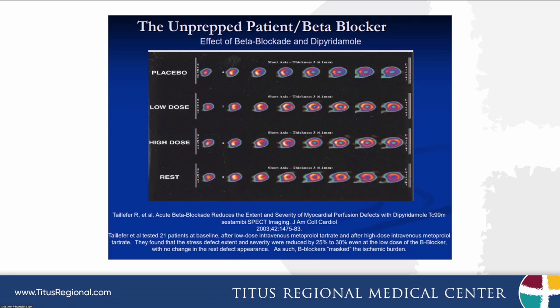When we talk about holding these medications and preparing the patient appropriately for a stress test, it's not just because of some arbitrary standard. It's because it really makes a difference in whether or not these tests are going to be accurate and are going to be interpretable for the patient. If we don't prep the patient correctly, then we're wasting their time and their money to do the test, and we may come up with an erroneous result.